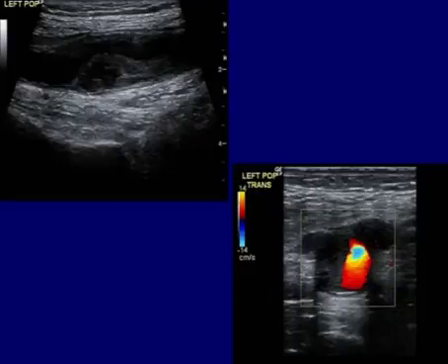Now, when we start to see disease, we can see all levels of disease, not just plaque. As I said, we can see here a nice segment of the popliteal artery that looks very normal, but then we see this dilated segment here, consistent with a popliteal artery aneurysm. We not only see the dilation, but we also see all this debris in the vessel here, and that debris is laminated thrombus. That can present a potential risk to the patient.